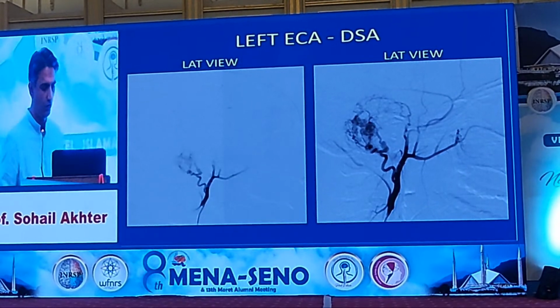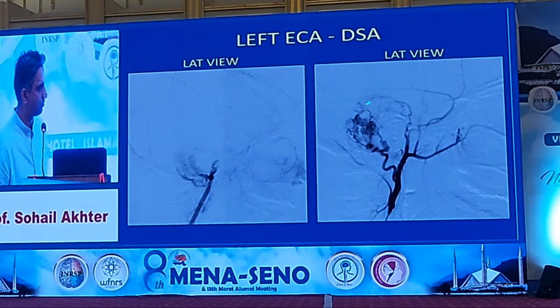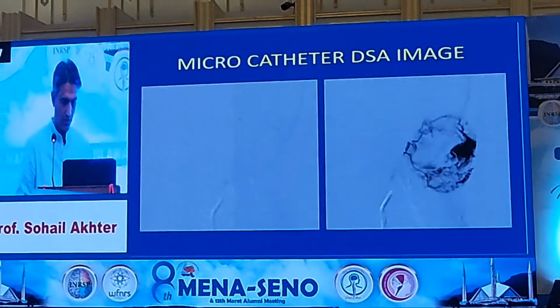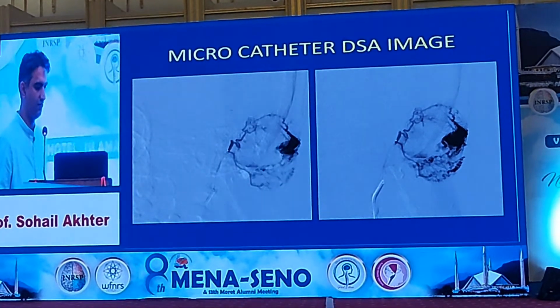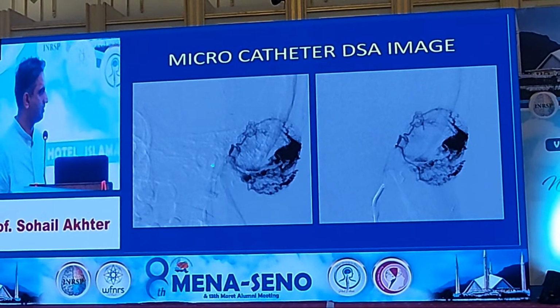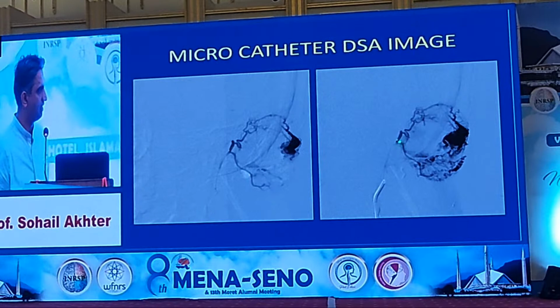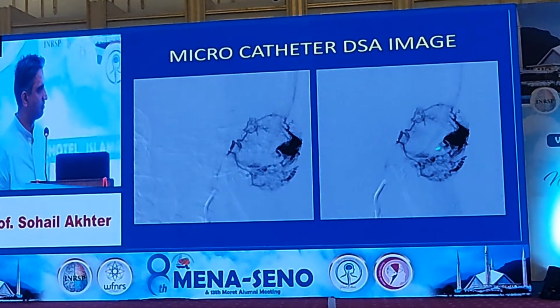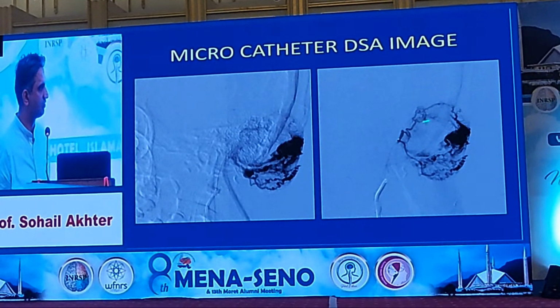It's a lateral view. You can easily see the feeders from the posterior auricular artery as well as from the superficial temporal artery. Now, I just want to emphasize the concept that while we are performing percutaneous puncture, just see the tip of the microcatheter is there and the run is being done. It is very difficult to reach this part of the malformation and obliterate it completely through these small tiny feeders.